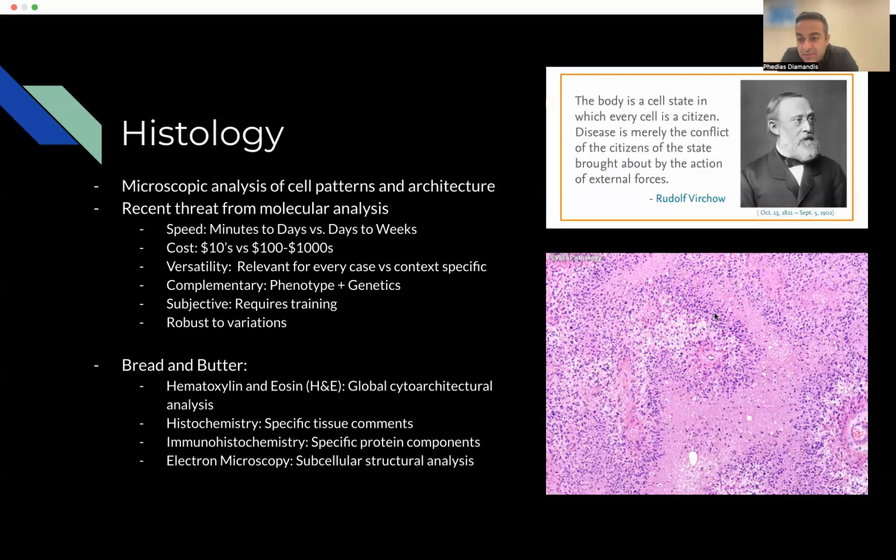And really we're seeing the cells retreat from these hypoxic areas that are usually caused by thrombosis of nearby vessels. So what you saw right there was the level of detail that we can extract from these very cost-effective slides, really showing just how powerful histomorphology is at not only finding abnormalities, but also classifying them into disease types, and even making very accurate predictions about the oxygen status of this particular region to the individual cell level.